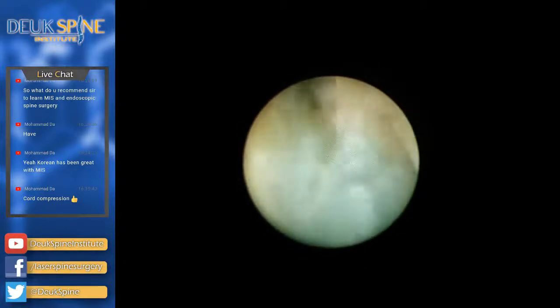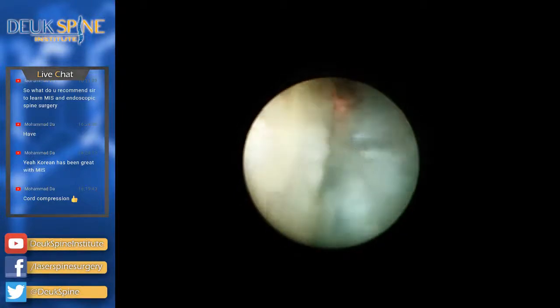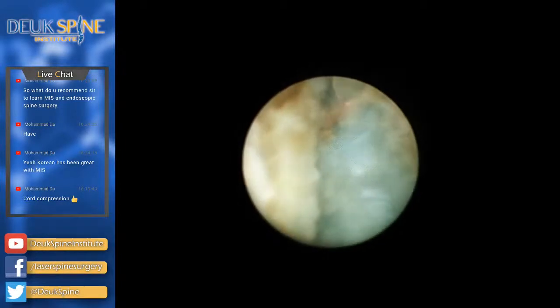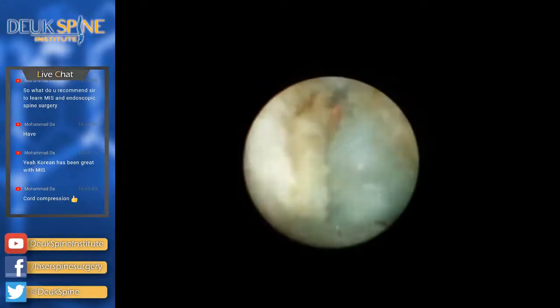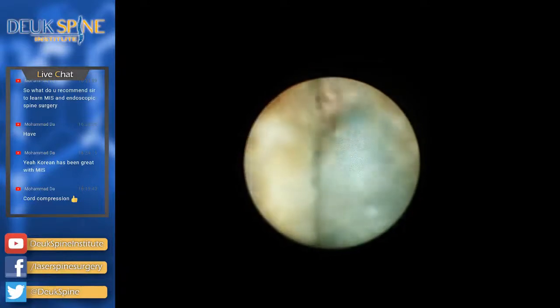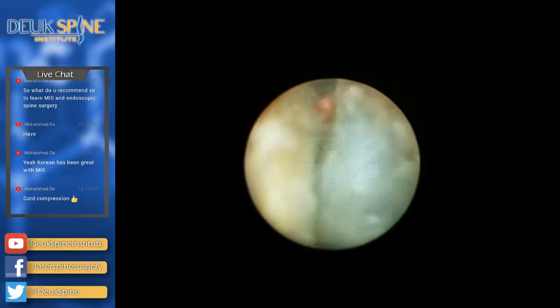This is all herniation right here. I'm sitting in it right now, inside the herniation, just in the foramen now. And you see the posterior ligament fibers right there. That's right where the nerve root's going to be, just underneath those. And I don't really want to mess with them. I just want to get the pressure off the nerves. That's my goal, and I'm doing that right here. That void that I've created now, folks, that whole void there is where the herniation was. Okay?